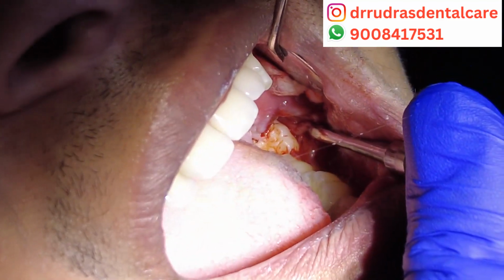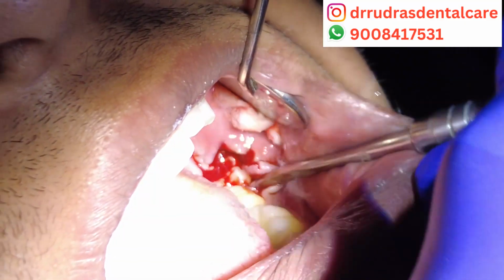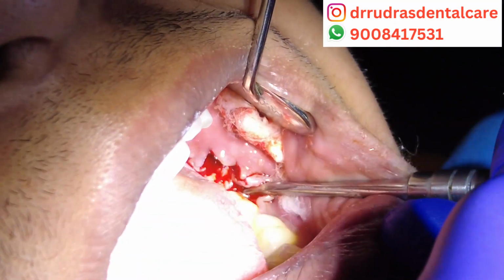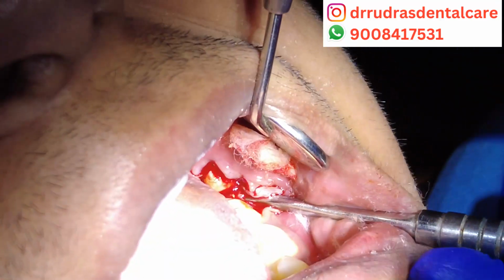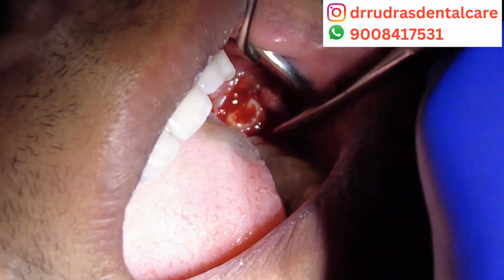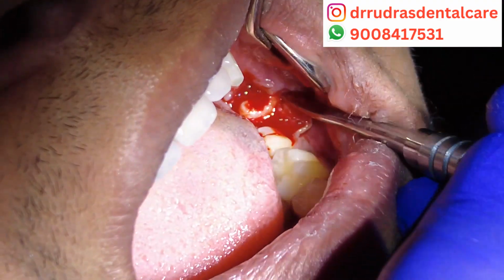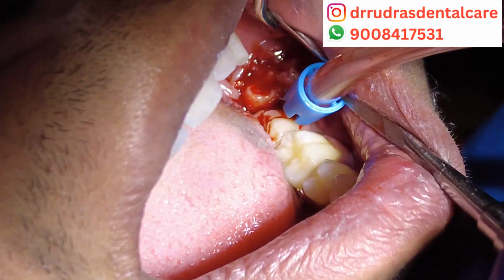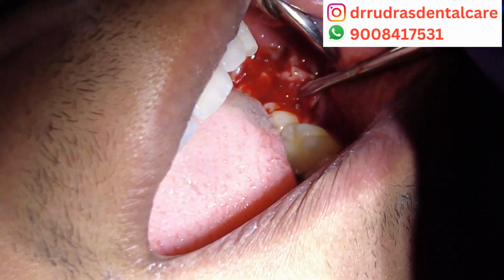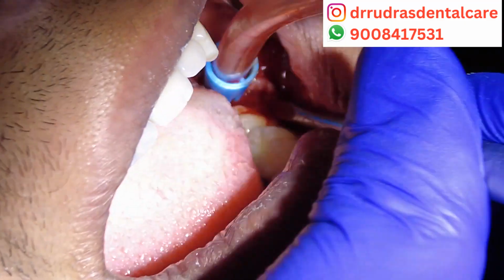We are using a point as a lever and a fulcrum, and then we are luxating the tooth out. Thankfully, to our relief, this tooth wasn't going to cause us much problems, and the tooth was luxating very easily on its own. The tooth has started moving in its socket and its alveolar bone housing. We are suctioning the field so that the oral surgeon Dr. Prabhat Sen can access the area and start removing the tooth.